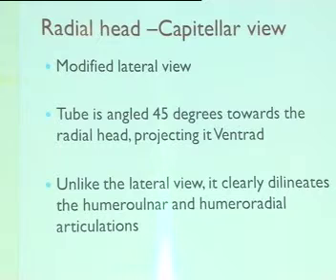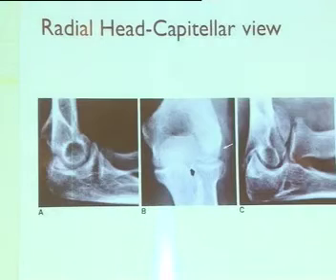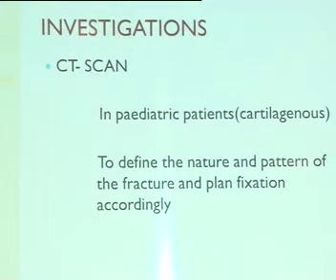It is a modified lateral view. The tube is angled 45 degrees towards the radial head, projecting it ventrad. Unlike the lateral view, it clearly delineates the humero-ulnar and humero-radial articulations. Like we see here, in the radial head capitular view, the fracture is very evident in the C picture. CT scan may be required in certain cases, especially in pediatric patients, to define the nature and pattern of the fracture and plan fixation accordingly.